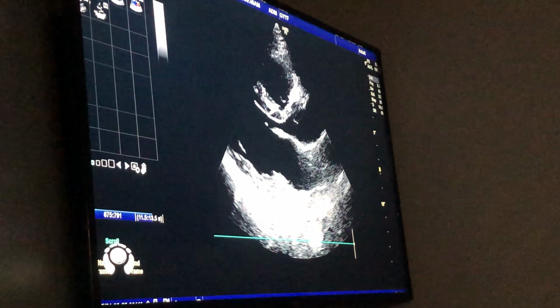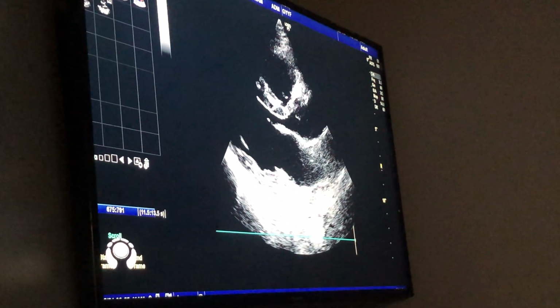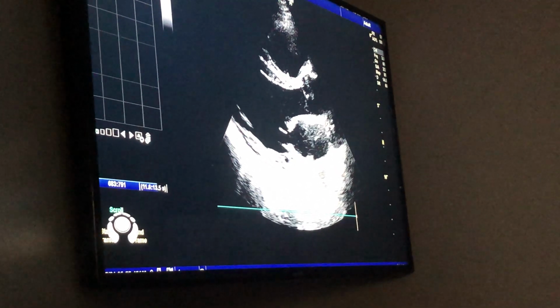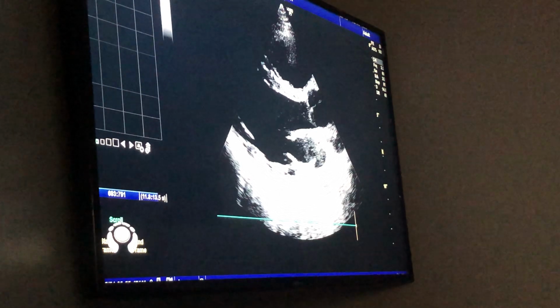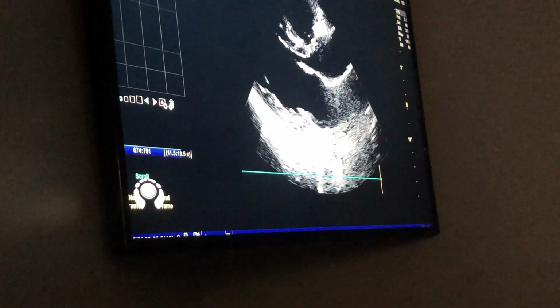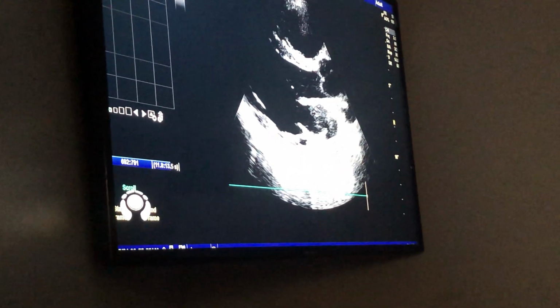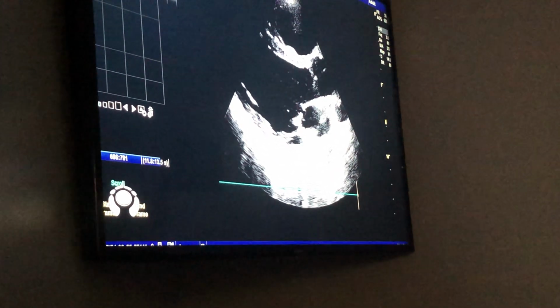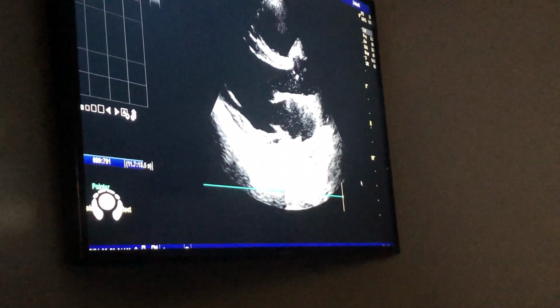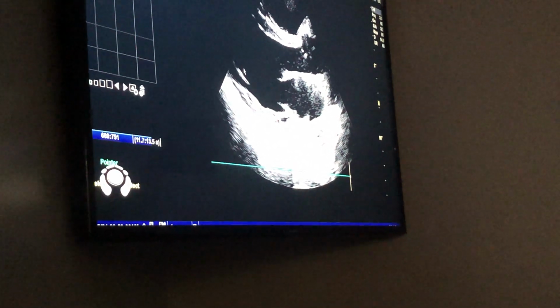It opens, opens, opens. By the way, this is early diastole. We're gonna get to diastasis right here in just a minute. It's gonna look like it's gonna close, but it won't. See? It went like this in early diastole. It kind of closed, it opened, and then it finally closed, right? So right here is when the pressure in the left atrium and the left ventricle are equal, okay?